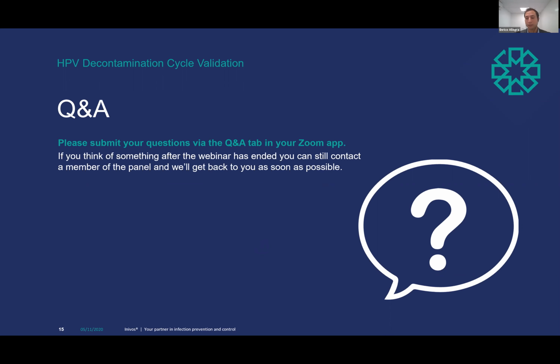So I see why people would still go back to BIs, biological indicators, as the gold standard. But my argument would be, if you're able to prove through a series of validations that your system is constantly delivering, and that if you reach those parameters it delivers death of the microorganism, i.e. the efficacy you're looking for, then you're validating your system.